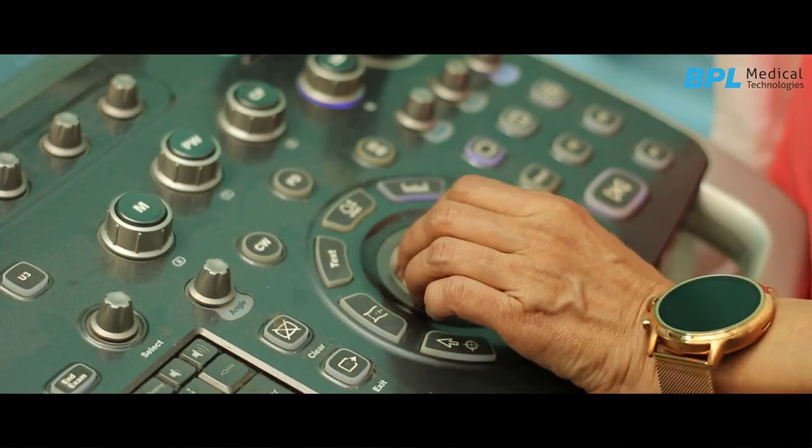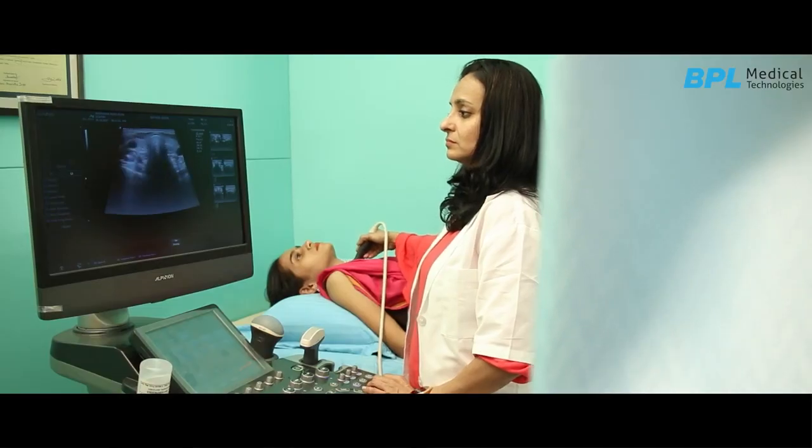There has been no fallouts or probe failure in this machine and the image has been consistent. There is no image degradation and the quality is the same as it was three years ago.